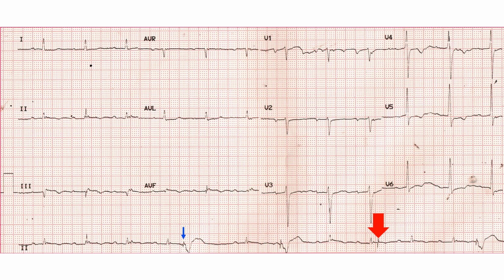Though it has not captured the ventricles, it does not mean capture failure, as it has occurred within the QT interval of the previous QRS complex when we expect the ventricles to be refractory. The rhythm strip shows 2 additional pacing spikes with ventricular captures also occurring fairly early after the previous QRS complex. Early occurrence again indicates sensing failure.